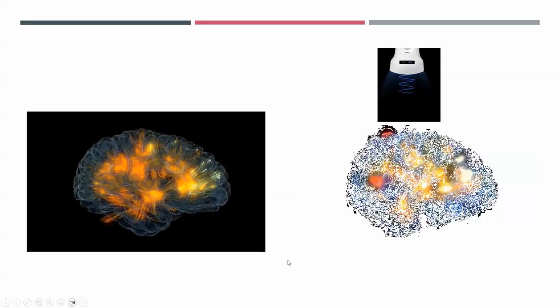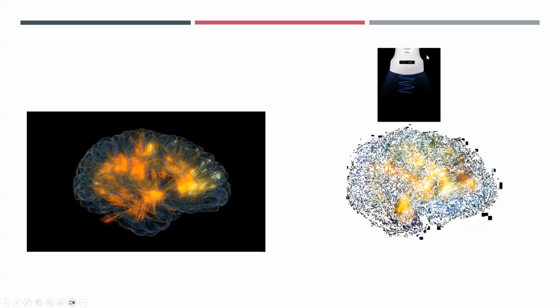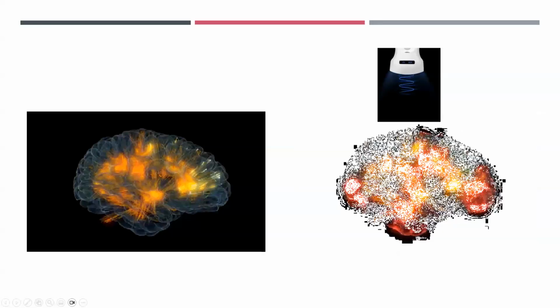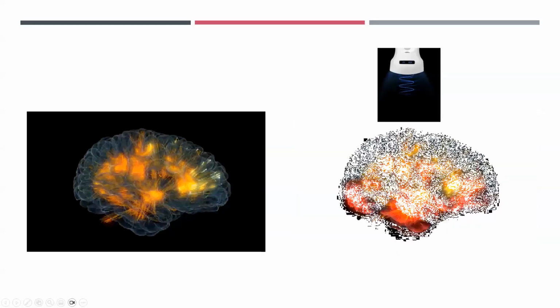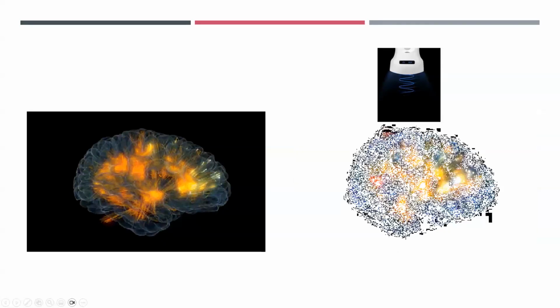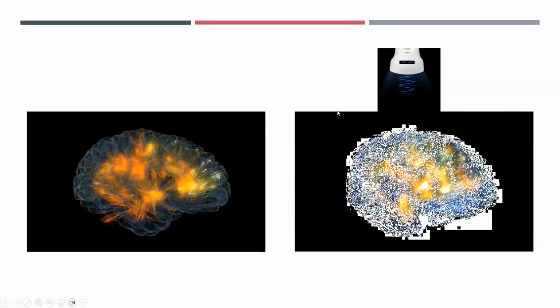So you can see at this particular point how the interactions are taking place with a high frequency probe. Naturally, because of good reflection, the superficial areas are seen much better. But what you're having here is sound waves getting trapped with attenuation. So the deeper structures will be seen less well.